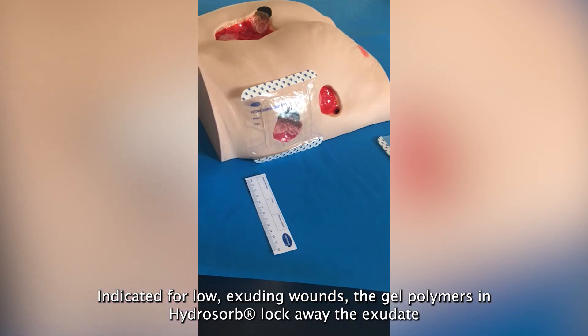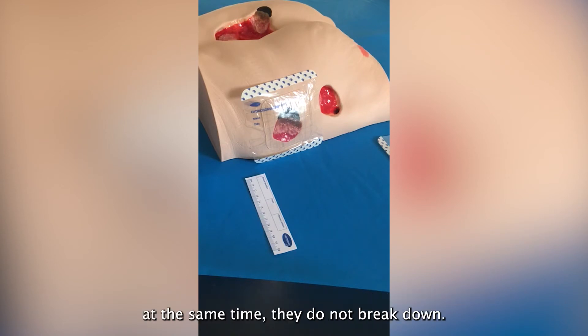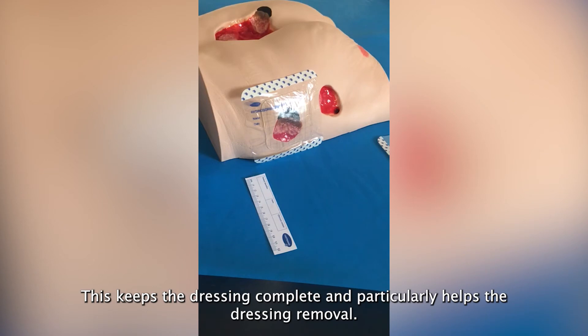Indicated for low exuding wounds, the gel polymers in HydroSorb lock away the exudate, and at the same time they do not break down. This keeps the dressing complete and is particularly helpful on dressing removal.